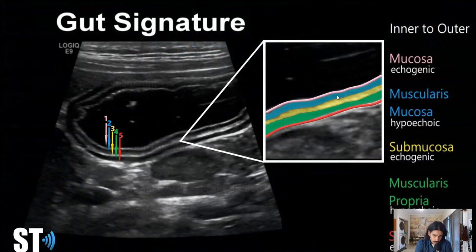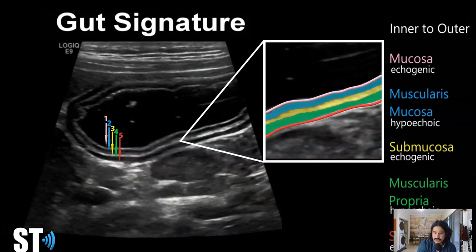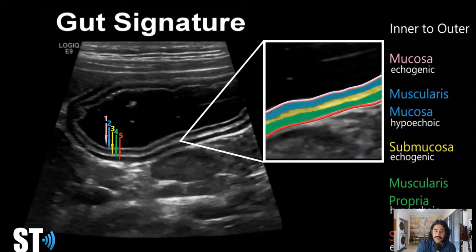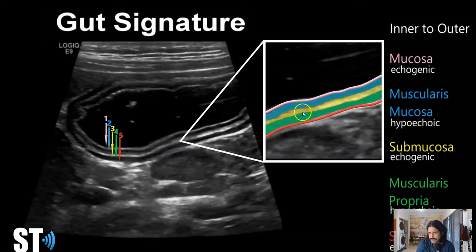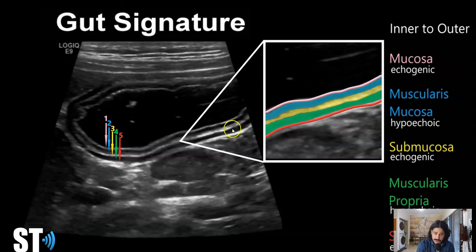Gut signature is a sonographic and histologic term. It refers to the five layers of the bowel. You don't have to remember all the actual layers. I typically focus on the middle layer, which is the submucosa — the hyperechoic layer. The five layers usually go from bright to dark: hyperechoic, hypoechoic, hyperechoic, hypoechoic, and then hyperechoic.